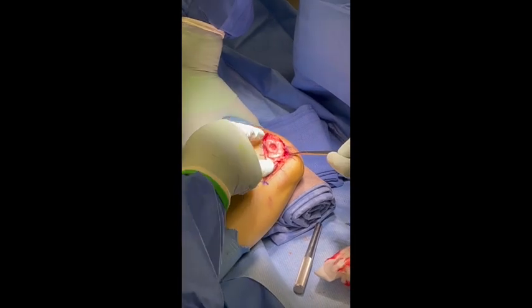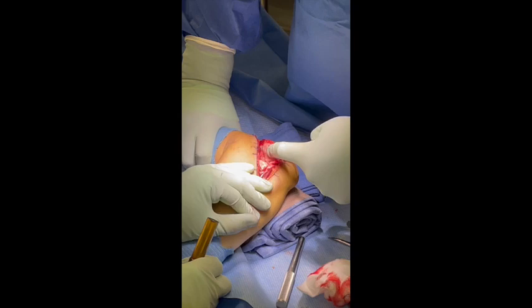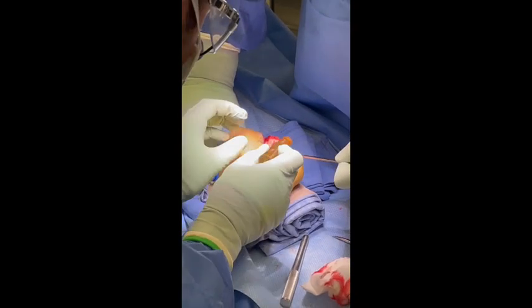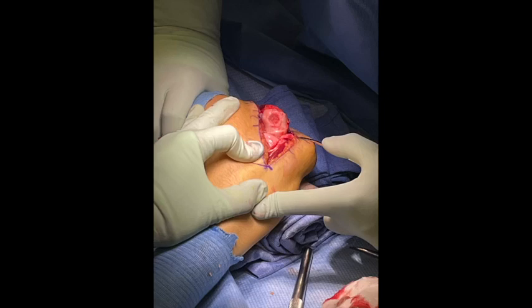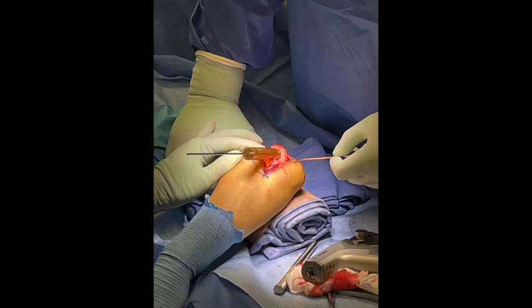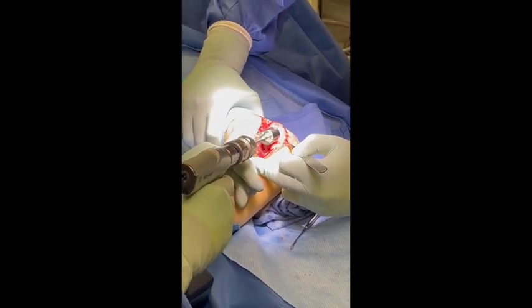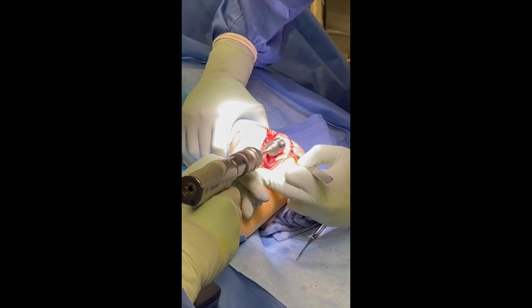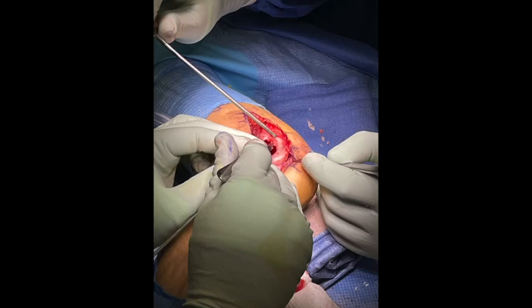The lesion was visualized, debrided, and the radial head was carefully protected and positioned so that perpendicular access to the lesion could be obtained. A 15 millimeter plug was selected and found to be appropriate size for this lesion. A K-wire was placed through the plug to ensure perpendicularity, and the lesion was freshened with the reciprocal reaming set to 15 millimeters with good contained edges and a clean cartilage line.